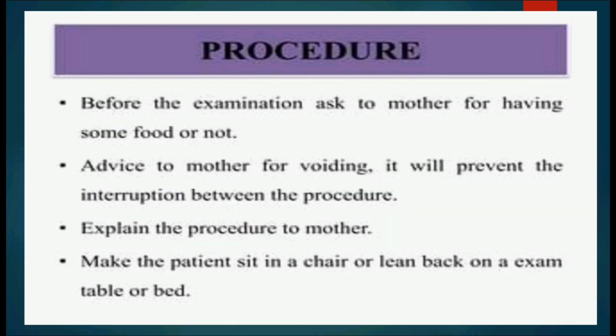So now let's see the procedure for NST, how we perform NST. Before the examination, ask the mother whether she has had some food or not. Advise the mother for voiding. It will prevent interruption during the procedure. Explain the procedure to the mother. Make the patient sit on a chair or lean back on an exam table or a bed.